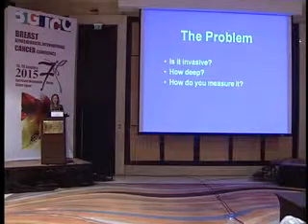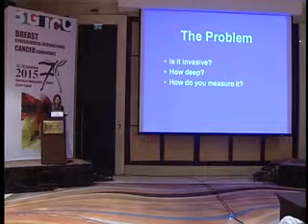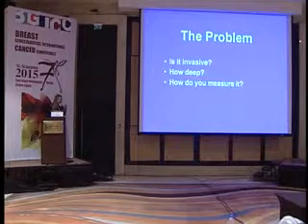Is it invasive or not? How would I evaluate this? Number two, how deep? How would I measure it? From where to where?